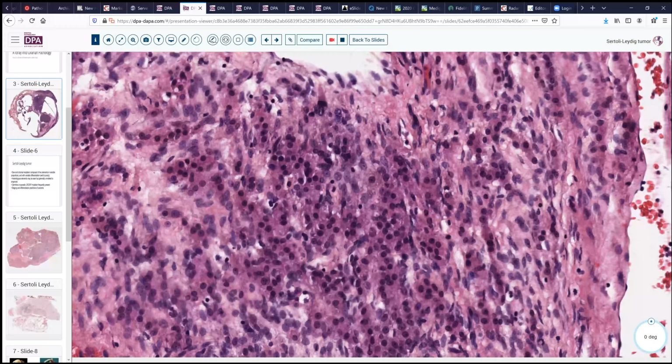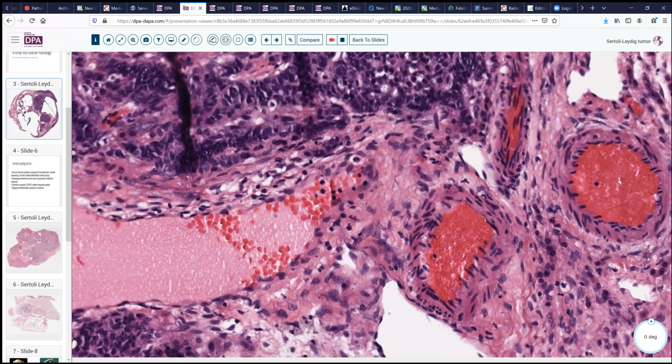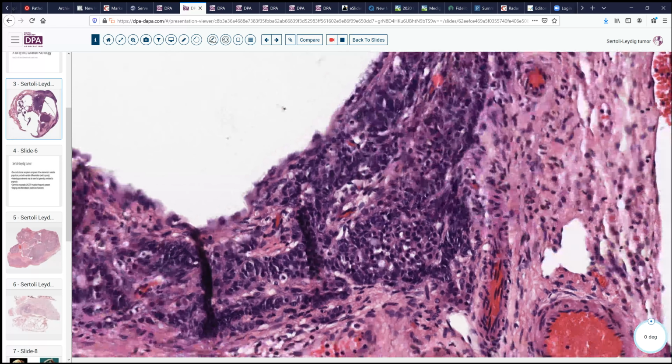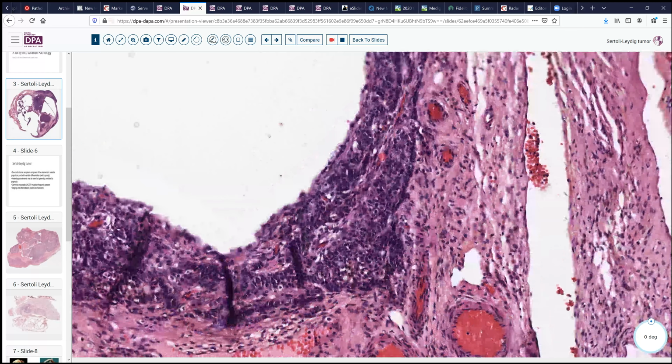They certainly have that appearance. And we think these other tumor cells, such as we see here, have a more epithelial type of appearance, appearing in cords, nests, and strands. And then we have these cystic structures.